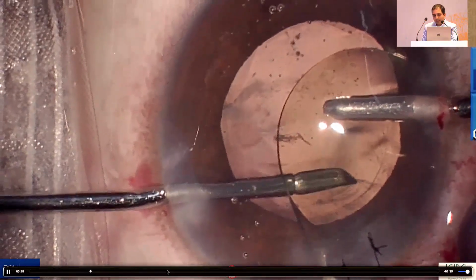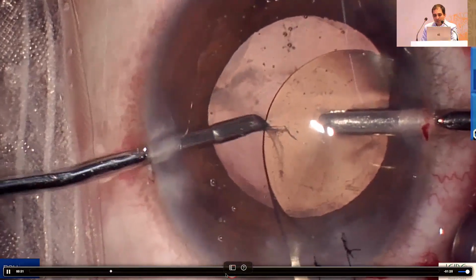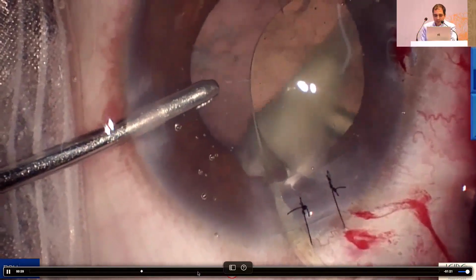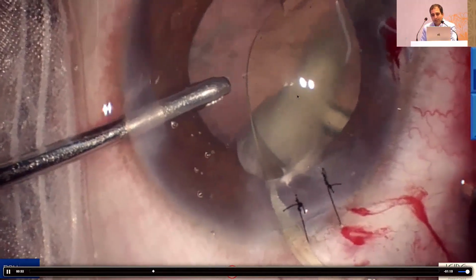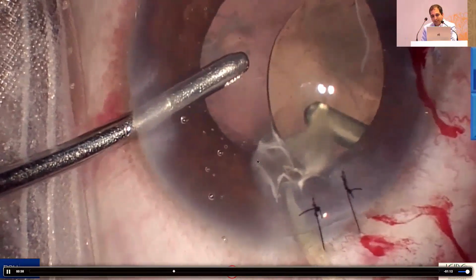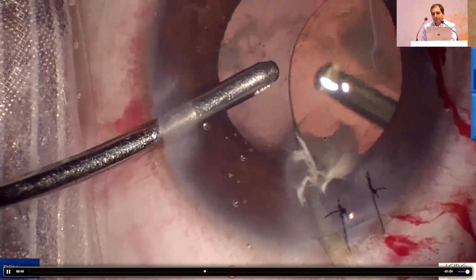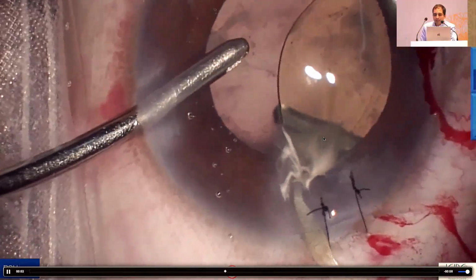And this flap from the other side, fortunately, now I could visualize. I've also converted that into a strong margin. So now my chances of extension of this tear are very minimal. The only way to identify the presence of vitreous is to inject triamcinolone. And you'll notice the advantage of pars plana: with the irrigation from the front and the vitrector from behind, there is no turbulence, and this entire blob is getting drained through this PCR. Slowly you'll see that this flap will start fluttering in the AC, which means the connection between the anterior and the posterior component is severed.